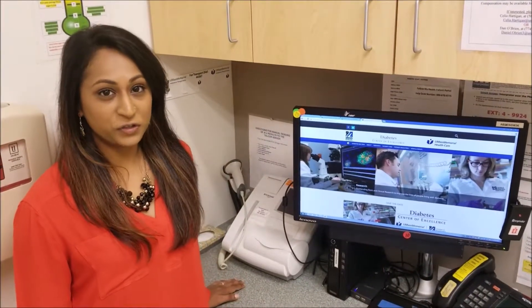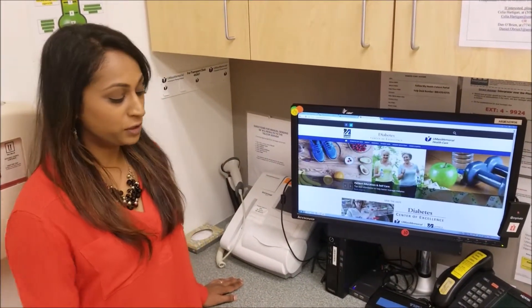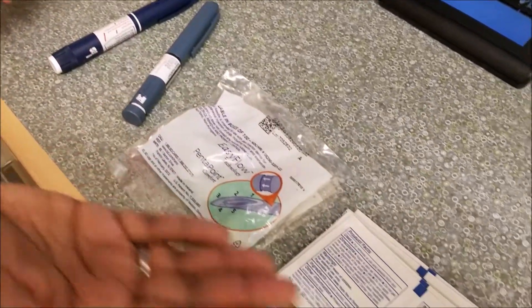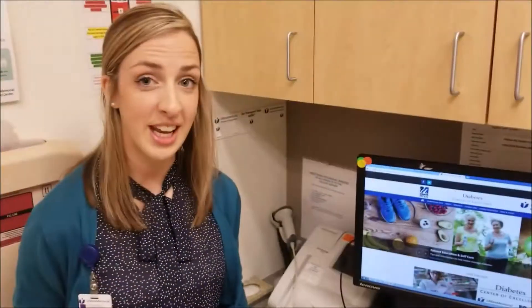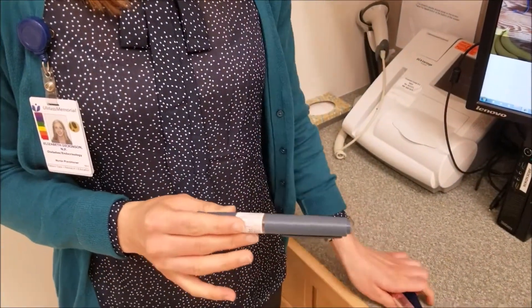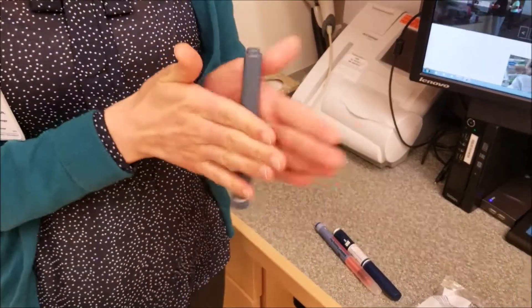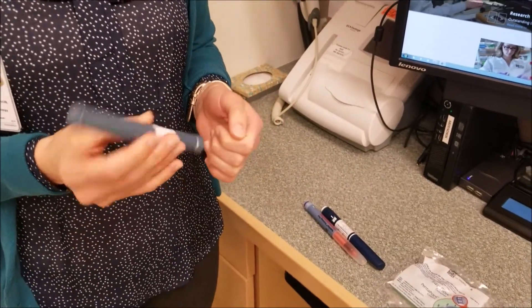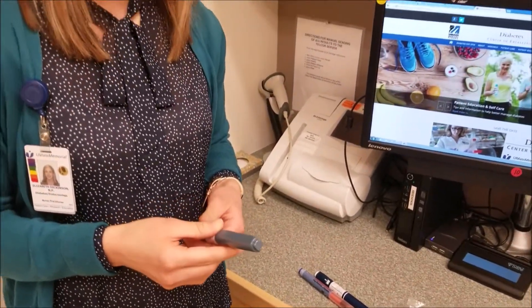First, you would have already checked your blood sugars, and then you would make sure you have all of your supplies — your pen needles and the alcohol pad. The next step is to check your insulin to make sure it's not expired. If your insulin is pre-mixed, you will have to roll it between your hands and then flip it upside down ten times. But if it's not mixed insulin, you can skip this step.